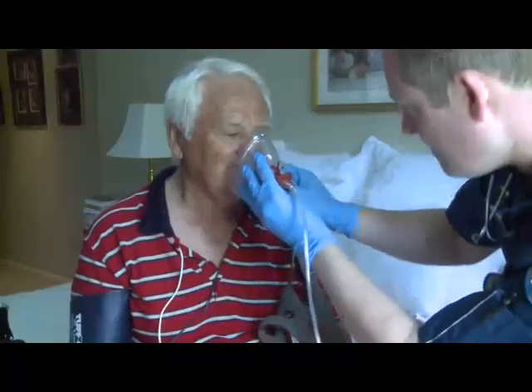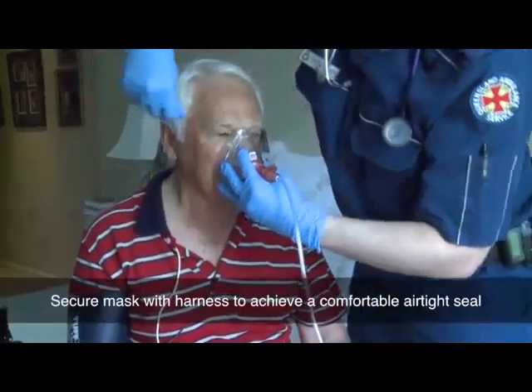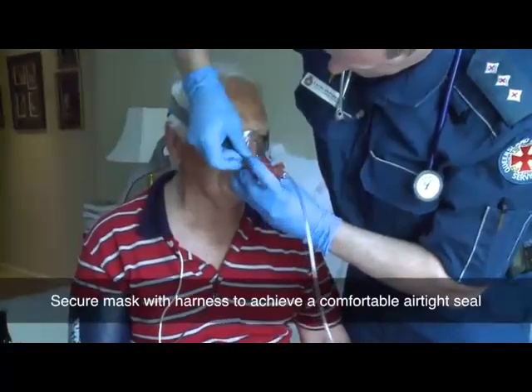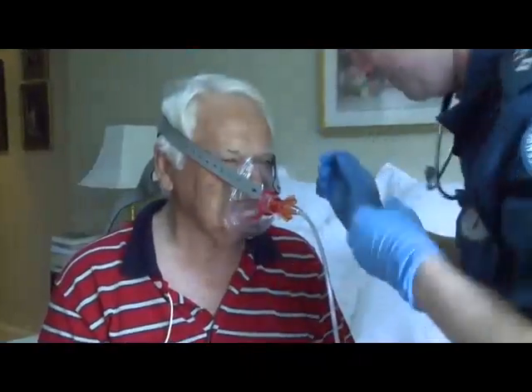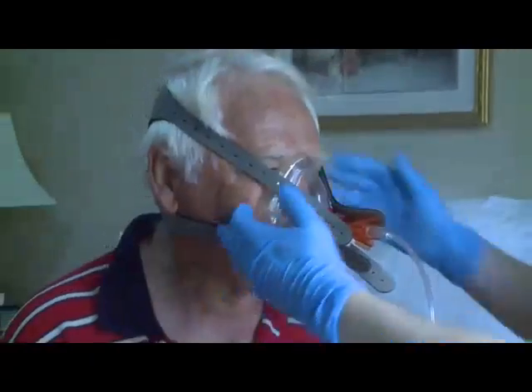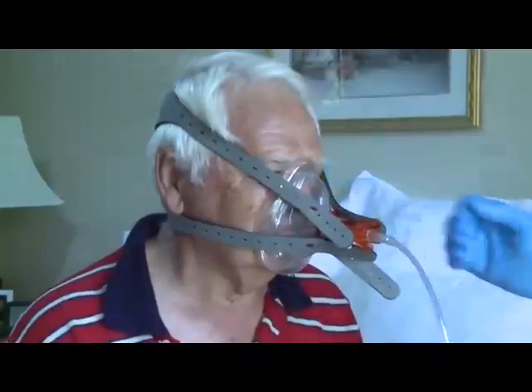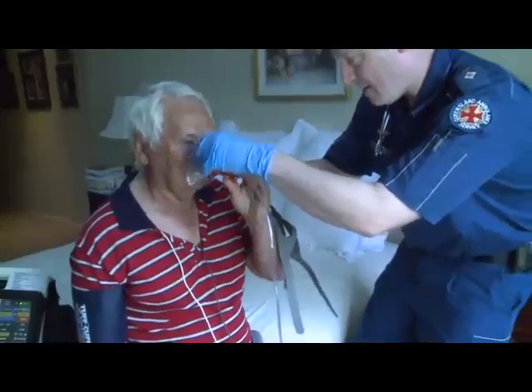Position the mask on the face of the patient and secure using the supplied harness to achieve a comfortable airtight seal. If the patient is apprehensive, ask the patient to gently hold the mask on their face and secure it when possible.